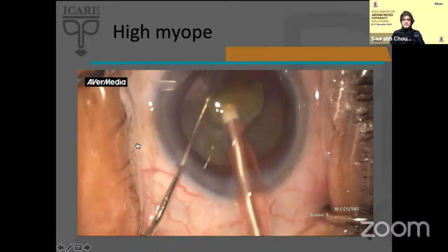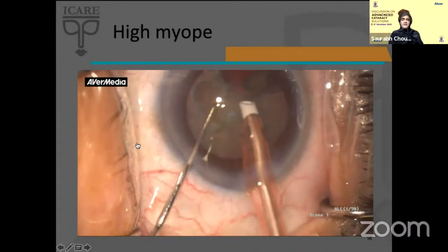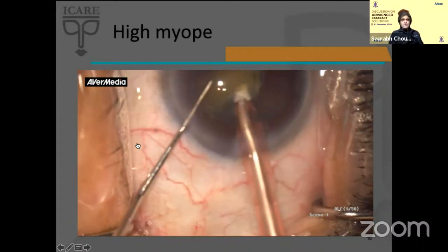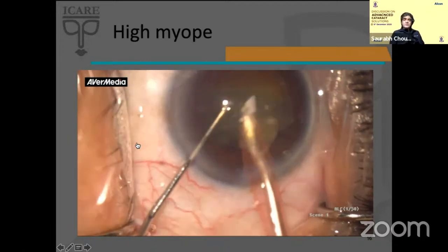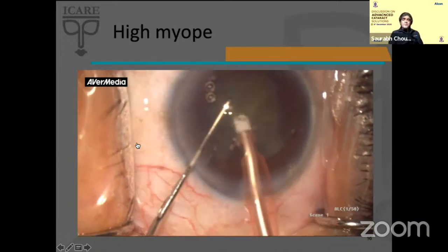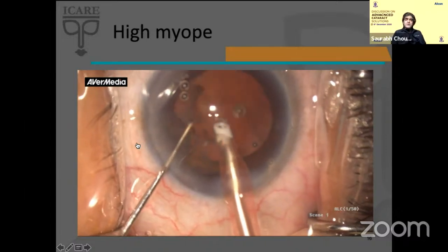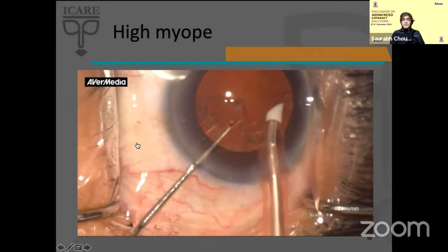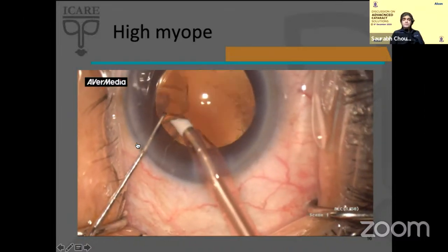So you just get it in, and you can check the followability. It just comes in very easily, and you're right in the center. And using minimal power, we're able to emulsify this. And this is a bigger chunk which I've taken, as this was a softer cataract, and it's a high myope. And I've kept the IOP at about 22 here. And using minimal power, still being a high myope, we worry about the fluctuations, but the active fluidics work very well here. And I'm able to remove the cortex here.